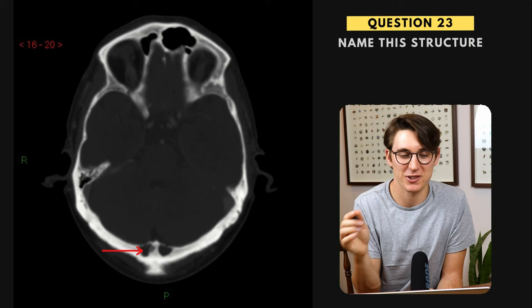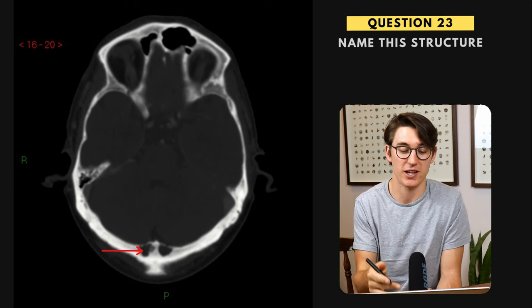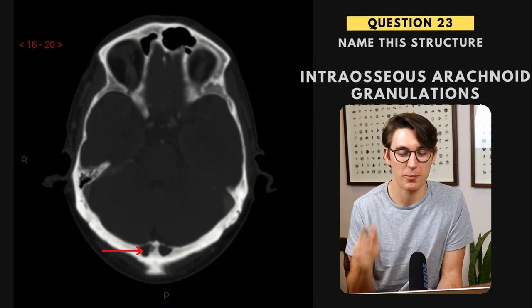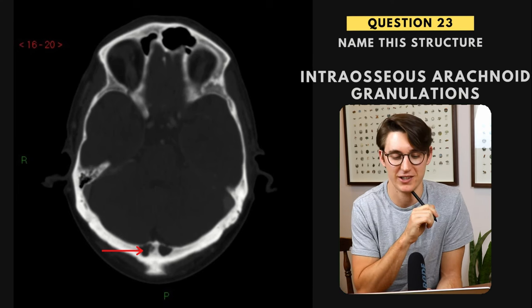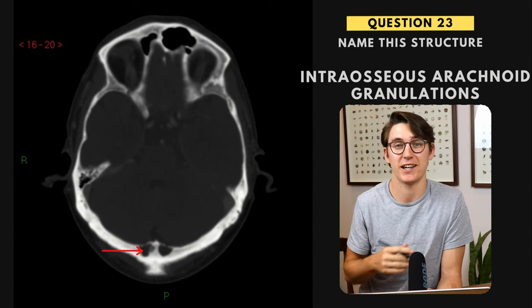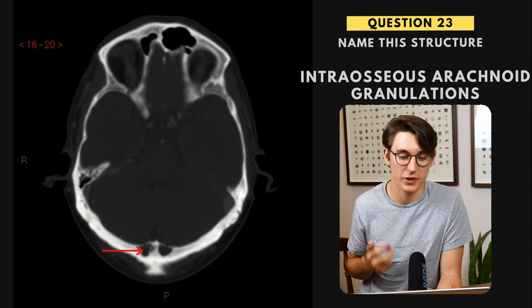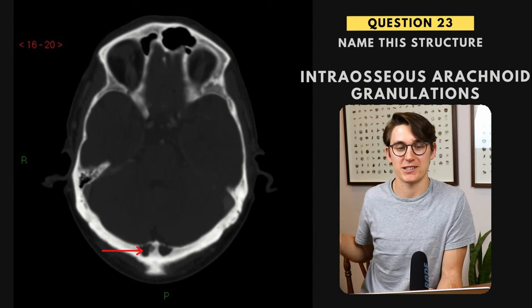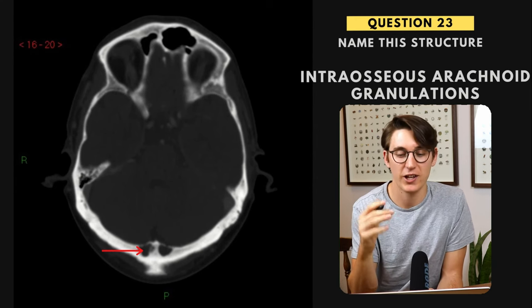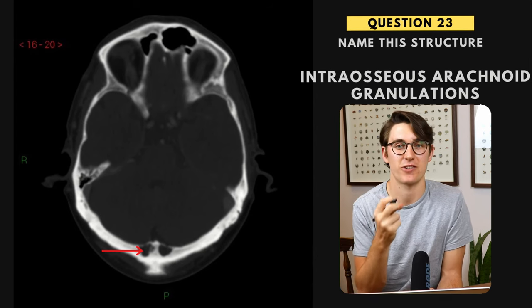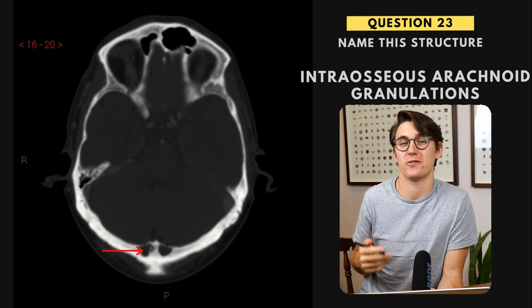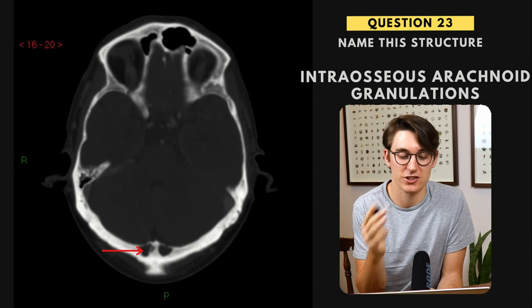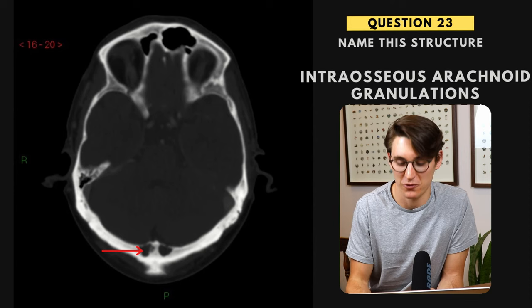Question twenty-three — this may look abnormal but it is a normal anatomical variant: intraosseous arachnoid granulations. Arachnoid granulations are what resorb our CSF and drain it into the venous system away from the brain. You can get intraosseous arachnoid granulations — they still function normally. These are not pathology, not lytic bone lesions. This is a normal anatomical variant.